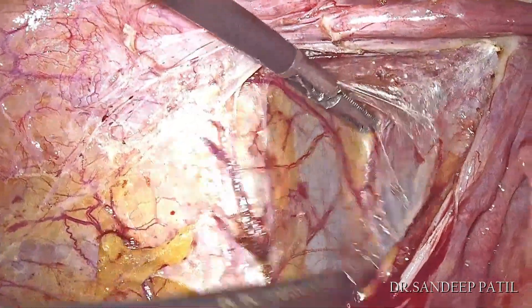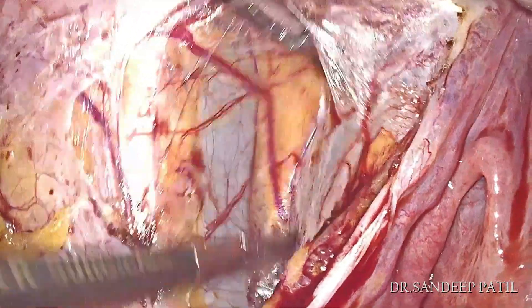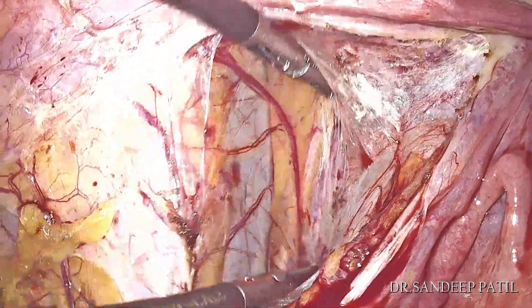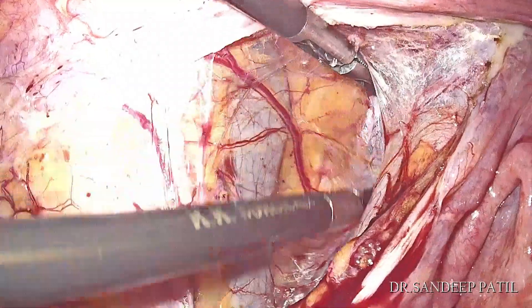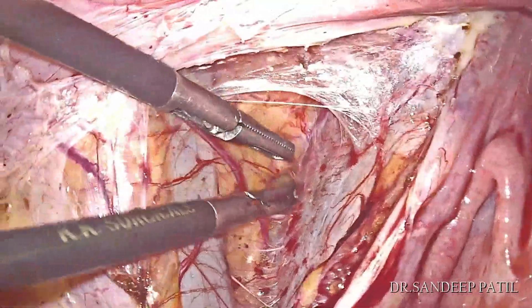Her MRI was showing twin fibroids at the cervix arising from its anterior lip, each measuring around 5 to 7 cm.